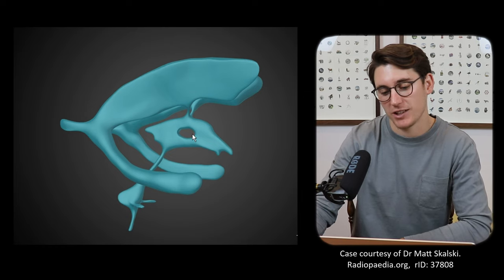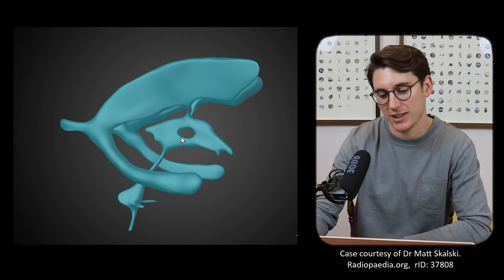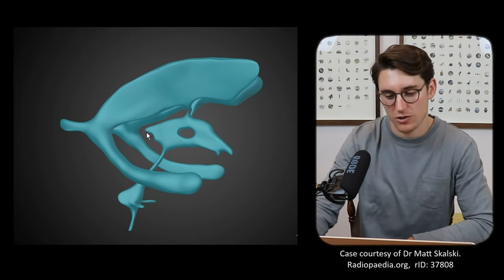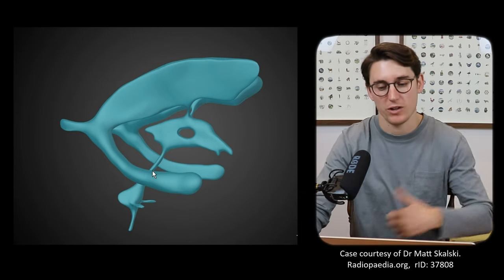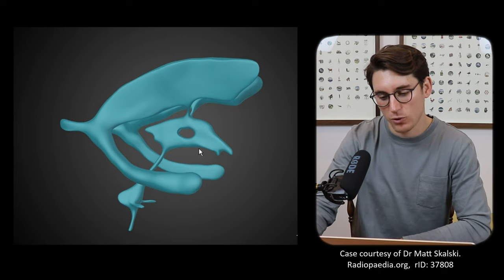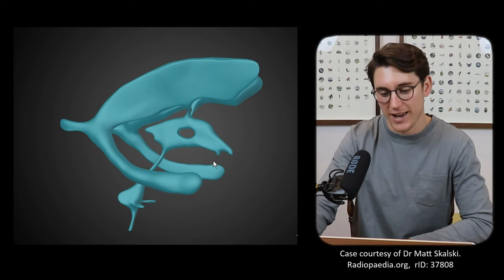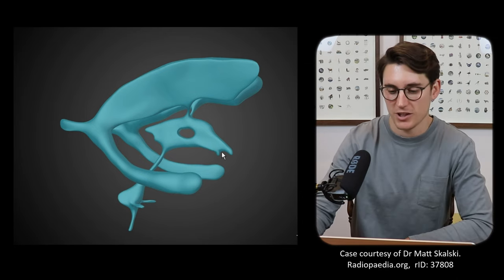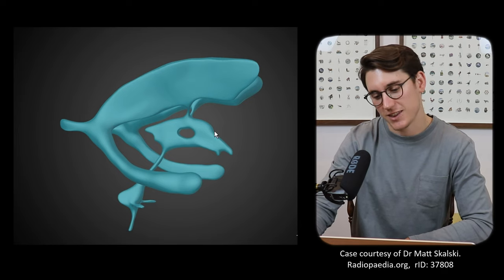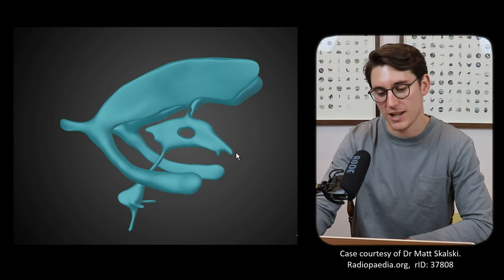We can see there's a hole here — this is only seen in some patients — that's where the thalami touch, and that's known as an interthalamic adhesion. Posteriorly to that third ventricle we'll have our pineal gland. We have our cerebral aqueduct coming down to our fourth ventricle. The floor of this third ventricle is our midbrain coming up with our mammillary bodies, and then anterior to that will be our pituitary. This is our infundibular recess, and anterior to the pituitary is our optic chiasm — our optic recess here. There's a thin sheet of tissue on the anterior portion of the third ventricle: that's the lamina terminalis.